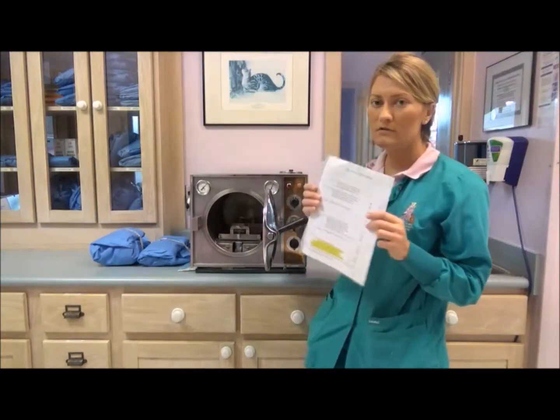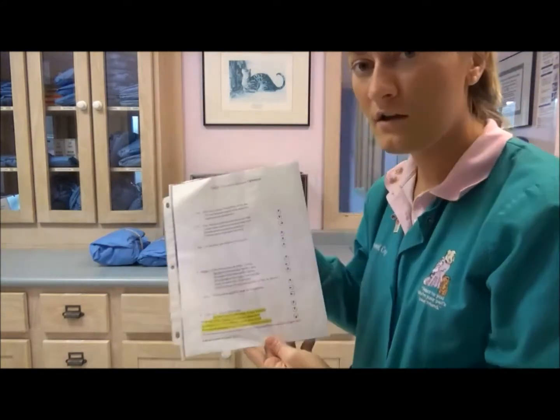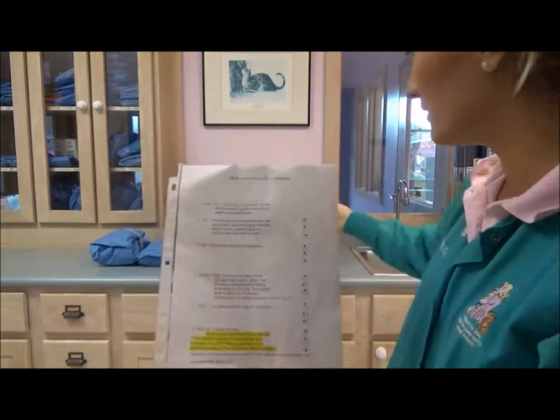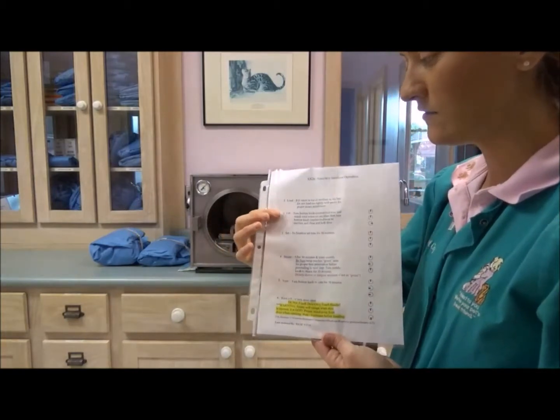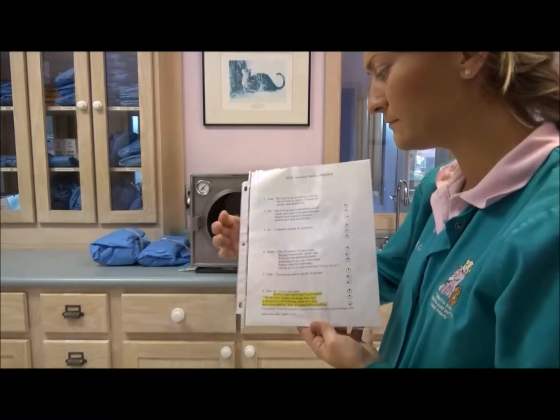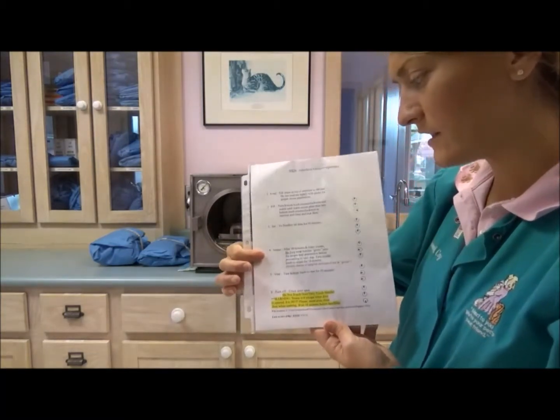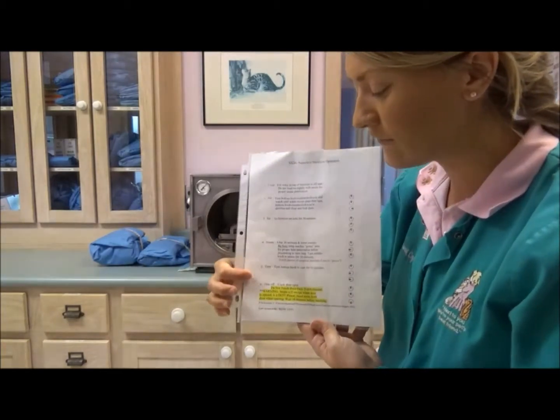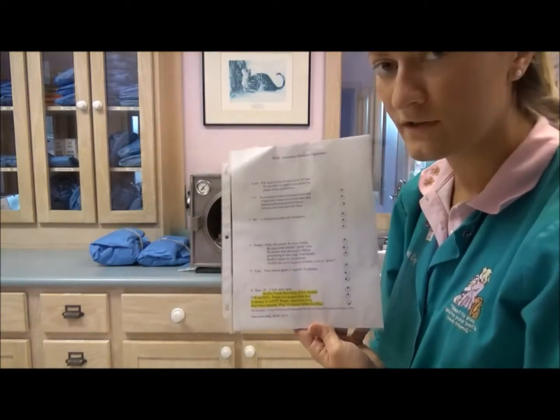So at our hospital, we have a little cheat sheet here that we always follow that tells us how long each cycle should last and which way you want to turn the knobs. So first you have to load the machine with the packs, and then you have to fill the machine with the distilled water at the bottom. And then you'll have to set the machine to sterilize. Next comes the steam step. After that is venting, and then after that you'll want to slightly crack the door open just to allow the machine to vent some more.